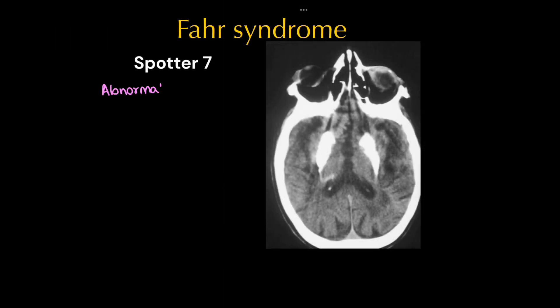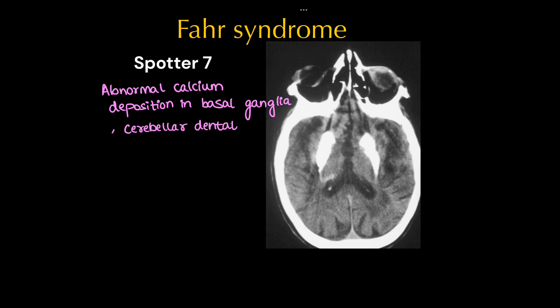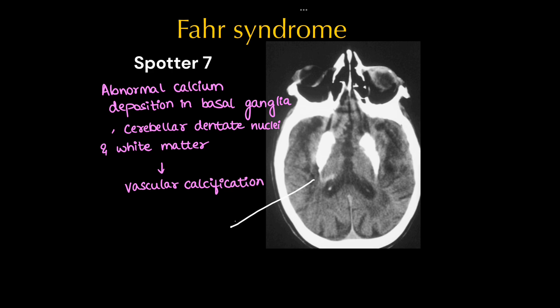This is a case of Fahr syndrome, where we can see abnormal calcium deposition in bilateral basal ganglia. The deposition will also be in the cerebellum, that is in the dentate nucleus, and in the white matter. These are vascular calcifications. In advanced stages, we can see symmetrical calcification of bilateral basal ganglia, and white matter calcification can be seen in later stages.